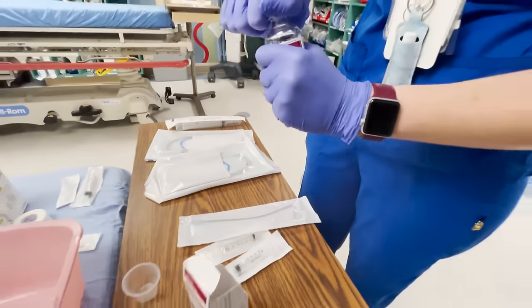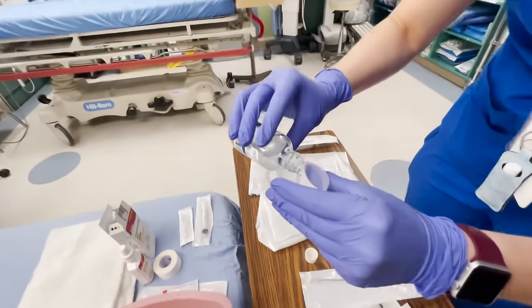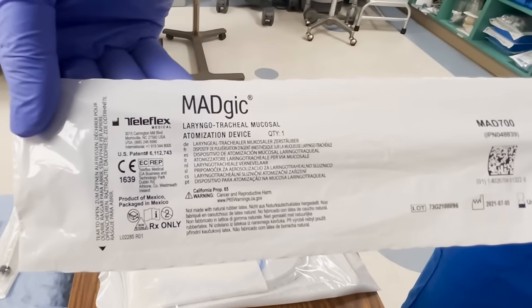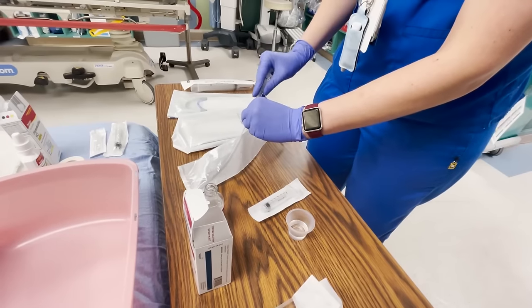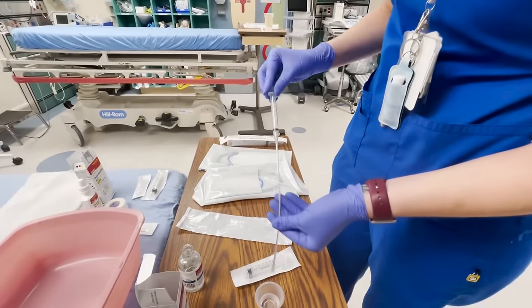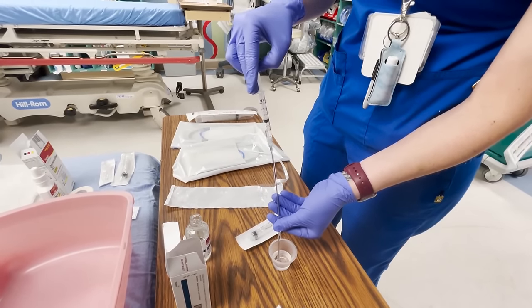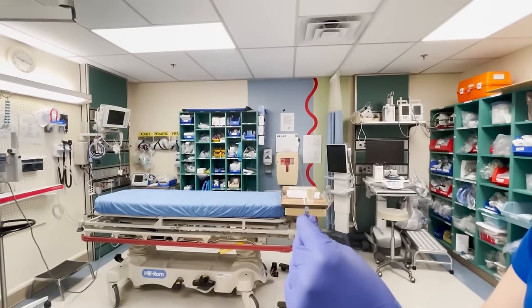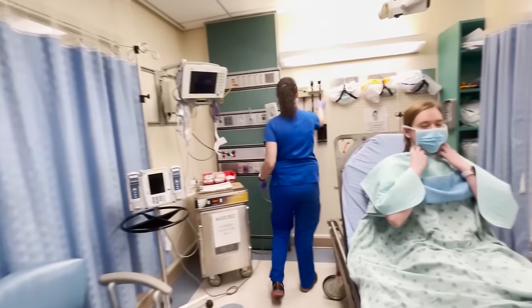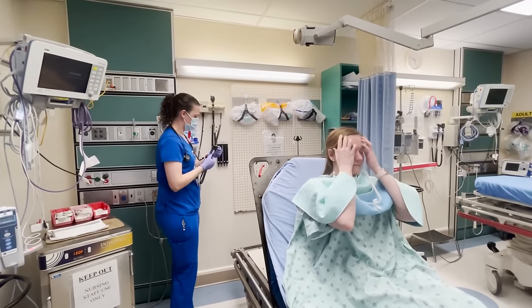This is your magic atomizer. The first step is to assess which nostril you're going to use.